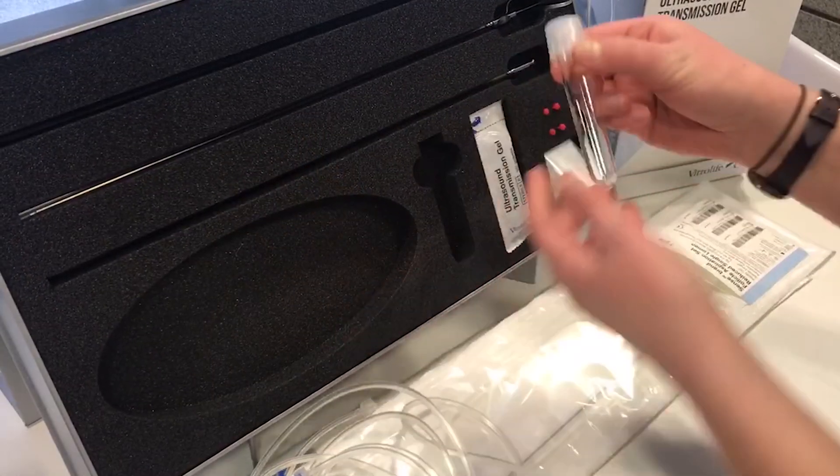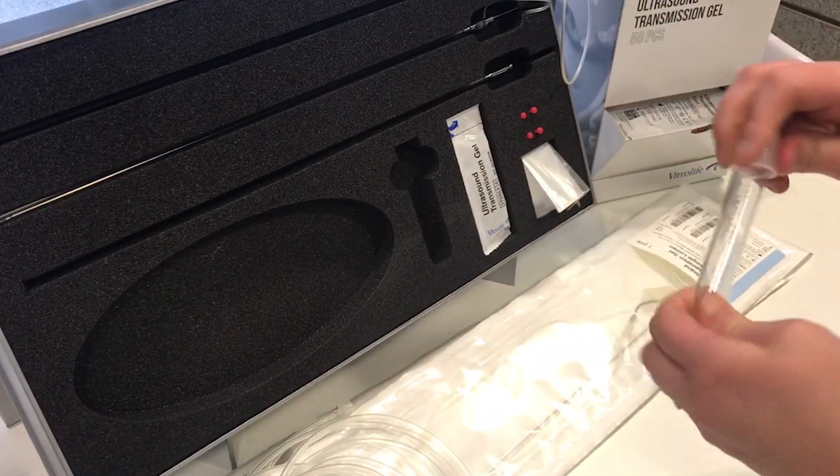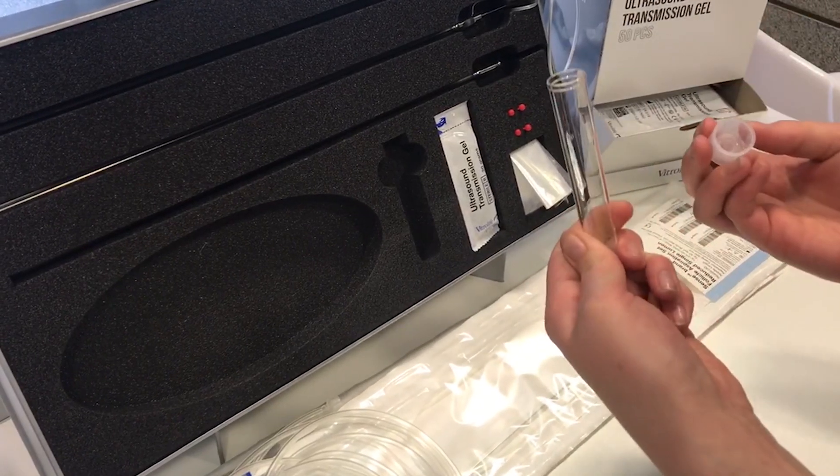Here we have our oocyte collection tube, which is of course CE marked, as everything is with FutureLife.